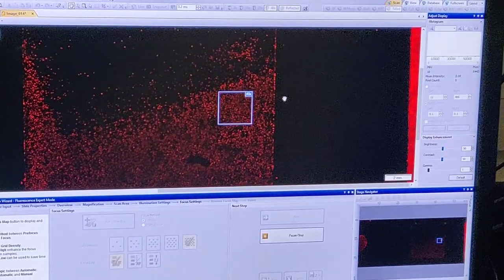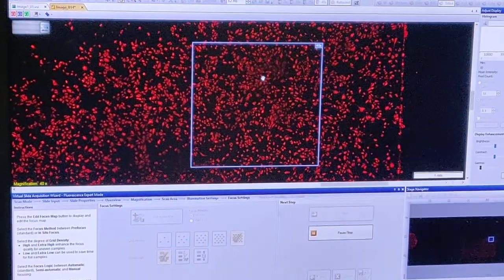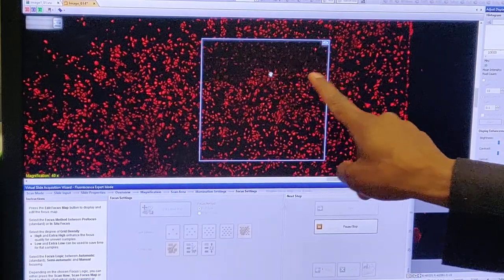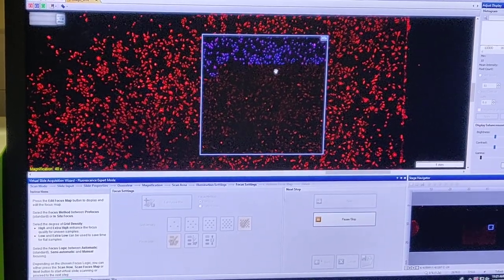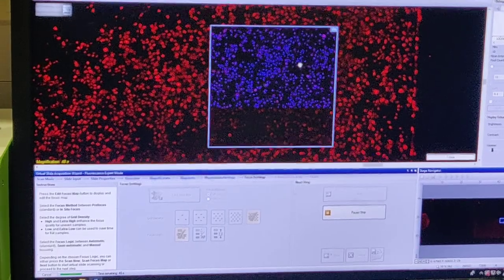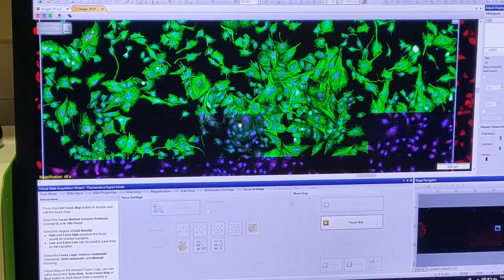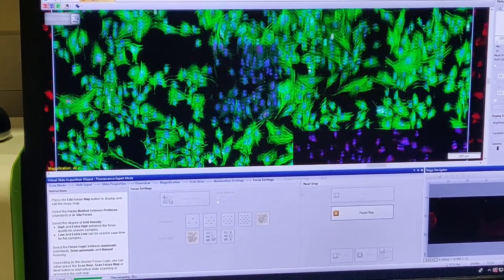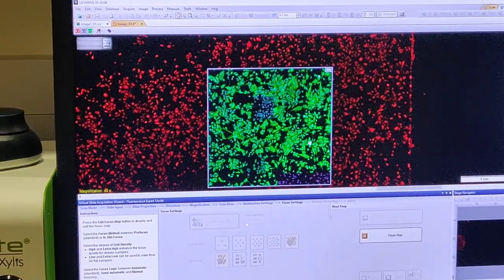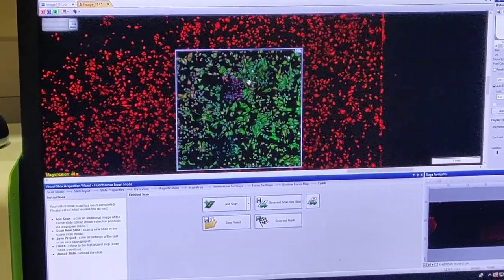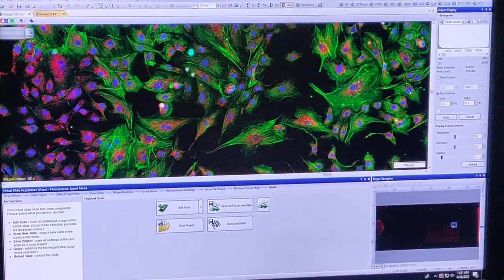Now it's going point by point rapidly, and as I zoom in you'll see it stitching images on the fly. It is attaching images one by one — first DAPI, then it fills in FITC. One area that was exposed a lot got photobleached. As soon as imaging is done, it auto-contrasts everything to the best color. This is my final stitched image.